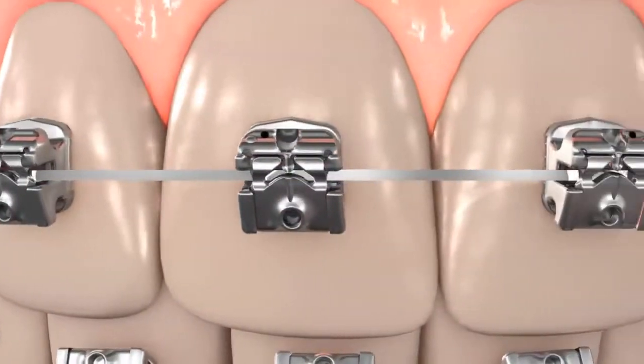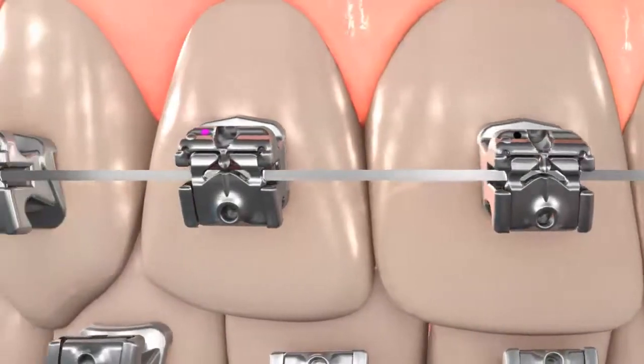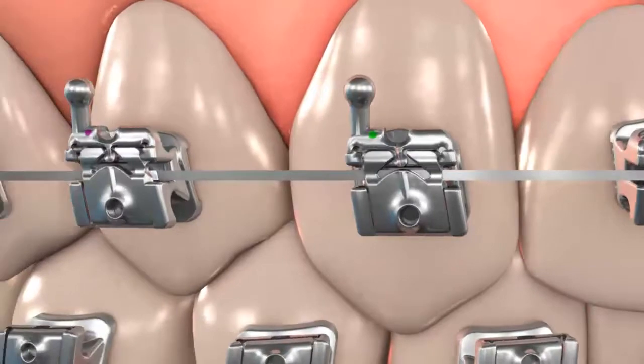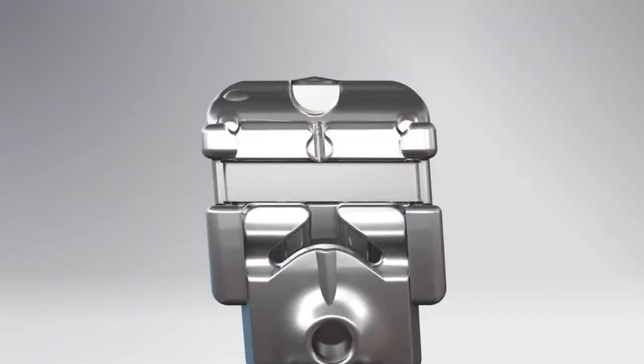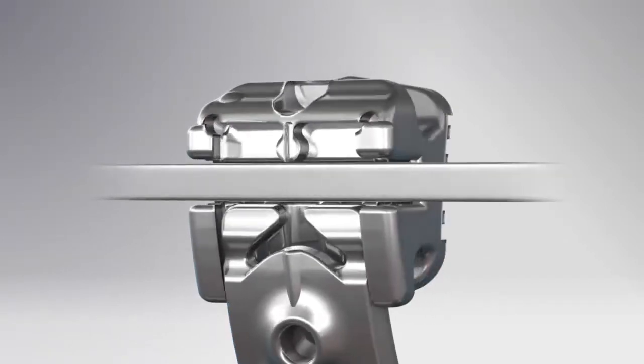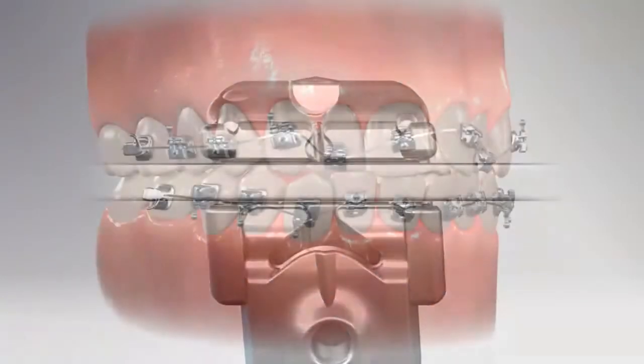This allows you to choose to have cuspids and bicuspids with secured, built-in hooks, eliminating the need for expensive, hard-to-handle drop-in hooks. All Carrier SLX brackets open towards the incisal edge, occlusal plane, away from the tissue. This avoids gingival impingement, especially on lower posteriors.